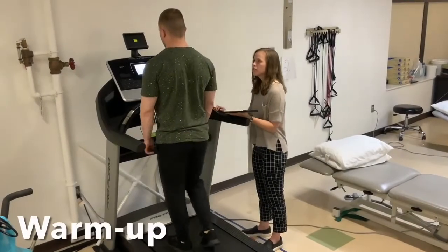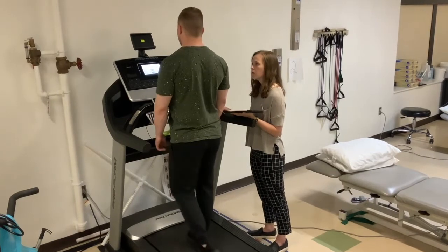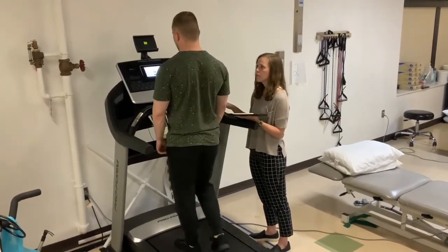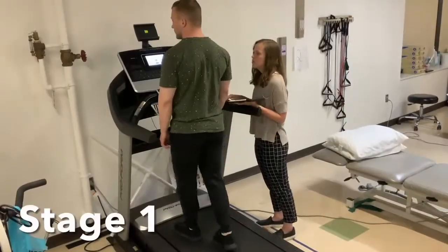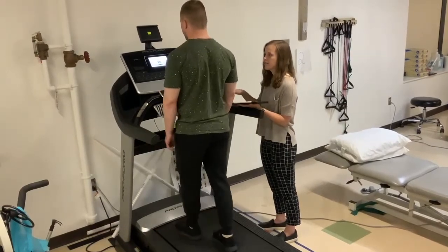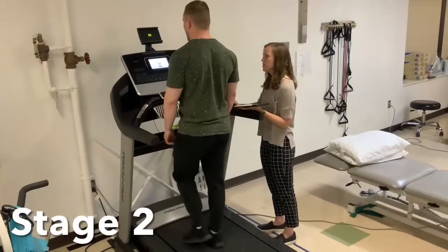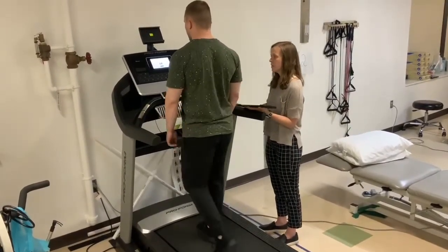All right, so we're just doing the Naughton Protocol today. So we are having you walk at 1 mile per hour, and then we're doing this for 2 minutes. This is just the warm-up, and then we'll get into the stages for the test. All right, so now we're at 1.2 for the speed, and we're gonna do this for 2 minutes. The incline is still at 0. So for this, we're at 1.5 speed, and still 0 incline. You're gonna do this for another 2 minutes.